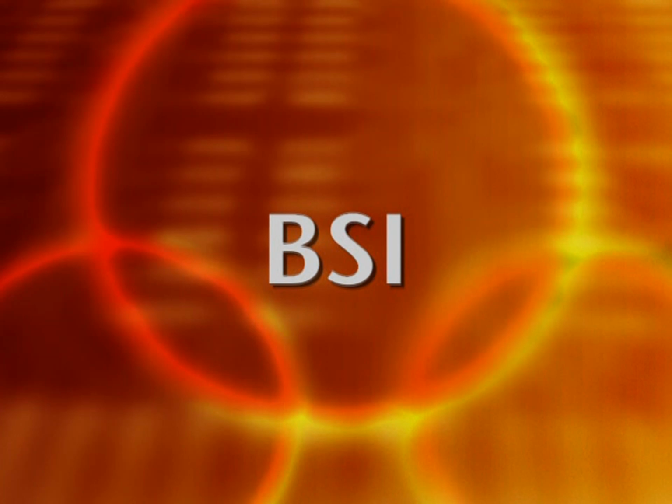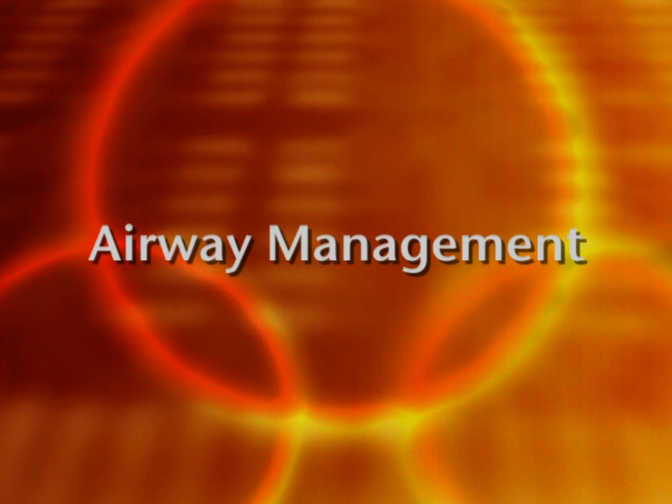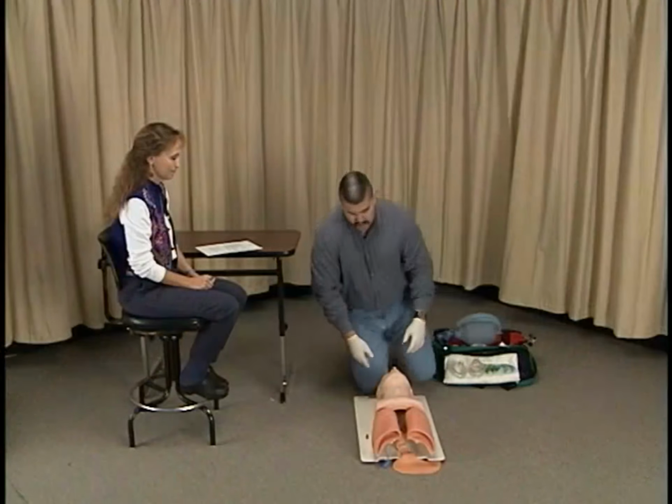Begin the station by indicating that the proper personal protective equipment is being used. Take proper body substance isolation precautions with gloves, mask, and eye protection. While positioned at the head of the patient, verbalize opening the airway and inserting an airway adjunct such as an OPA. Open the airway.